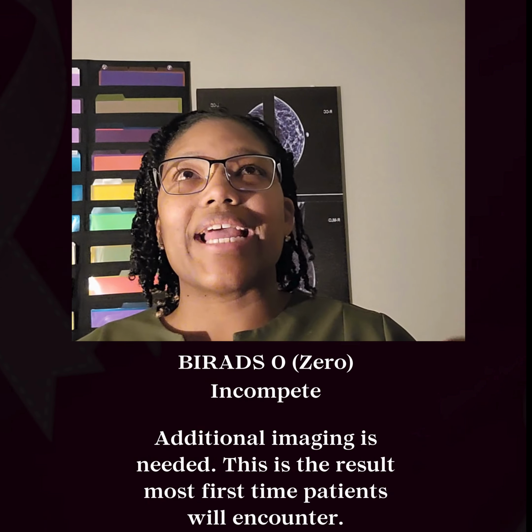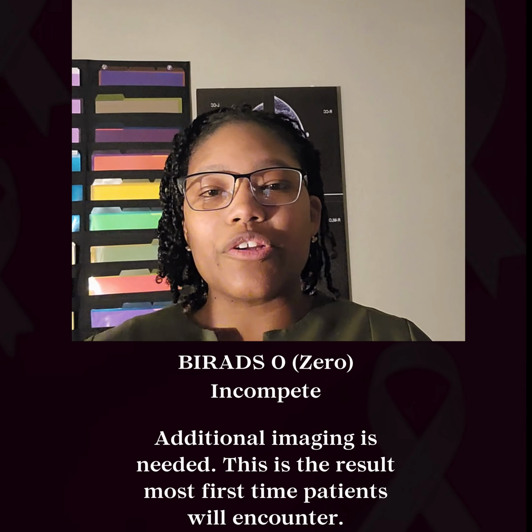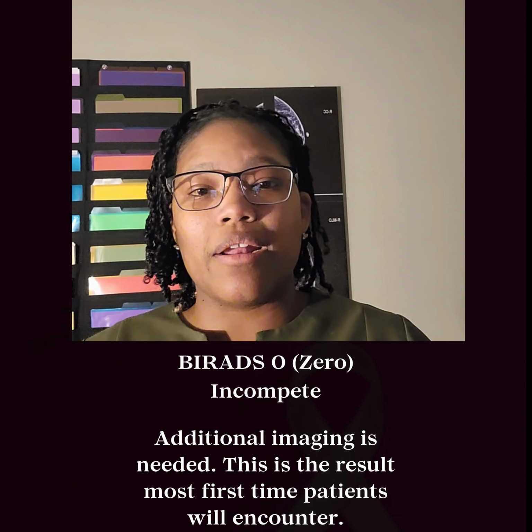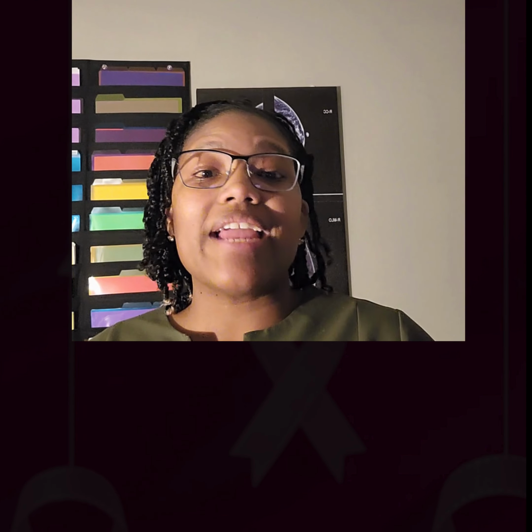That additional imaging can mean that your mammogram was not compared to other mammograms that you've had in the past, if you've had mammograms in the past. On the flip side, if they were compared, we may still need additional imaging, because of a tech repeat, meaning not enough compression, we missed some tissue, nipple wasn't in profile, all of that stuff.